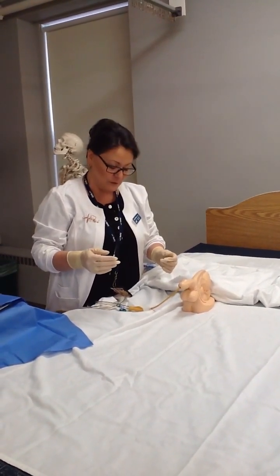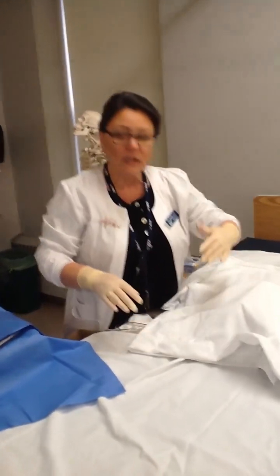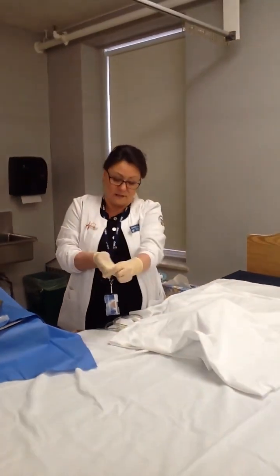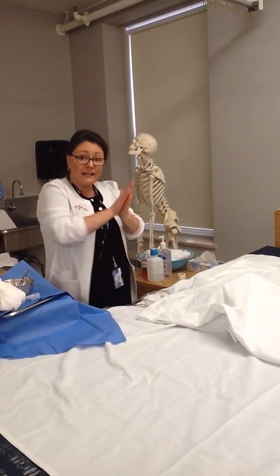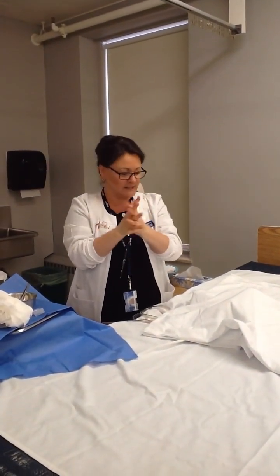And I would return my patient to a comfortable position, make sure the call bell was handy, and I would have cleaned up all of my equipment. I would have removed my gloves. Hand hygiene, you always perform hand hygiene before and after using gloves.